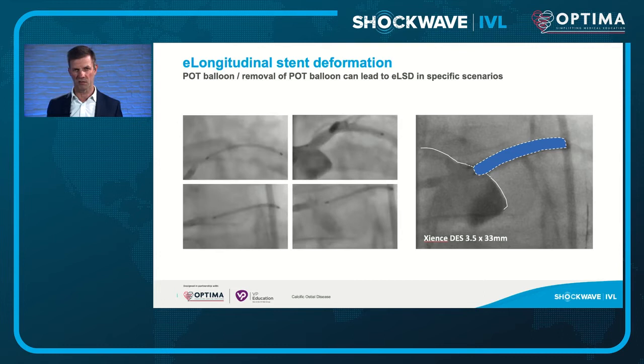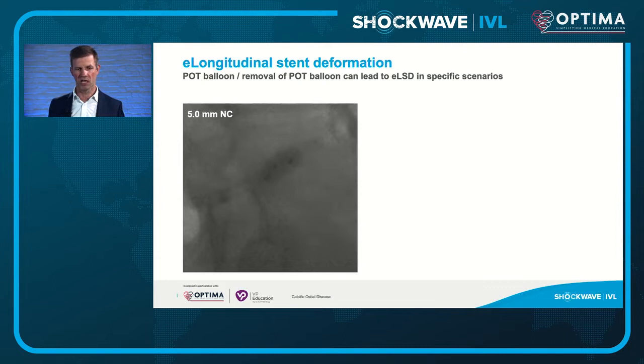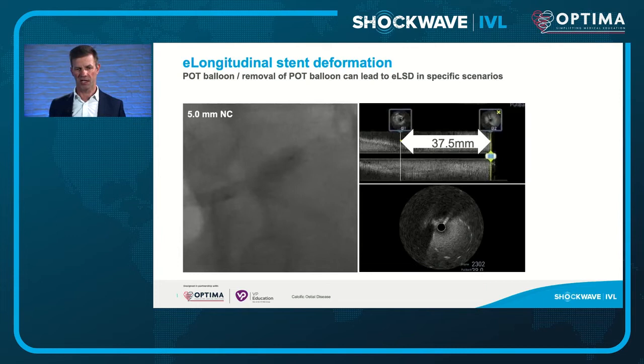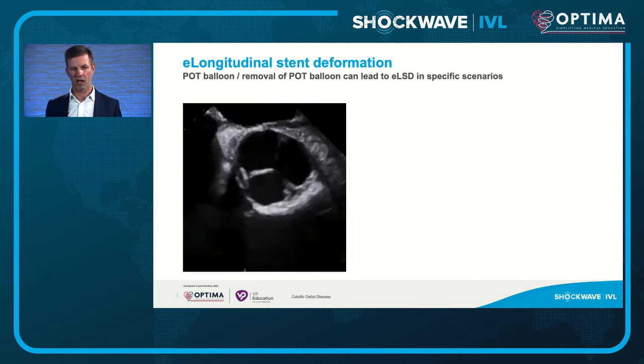After assessing on IVUS imaging, a POT balloon is used — first at the carina, then at the ostium. Measuring the stent length after POT, what was a 33 millimeter stent has elongated to 37.5 millimeters, and the stent now lands outside the aorto-ostium by this four millimeter length — a poor result demonstrating the risk of stent elongation with POT technique.